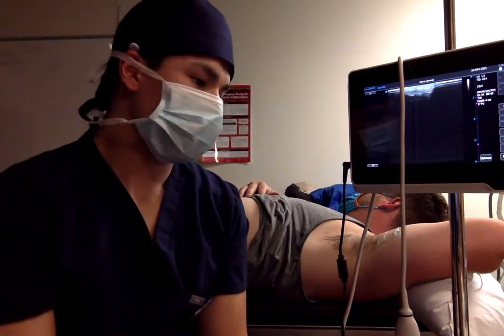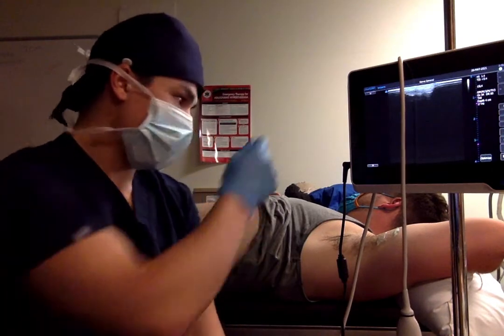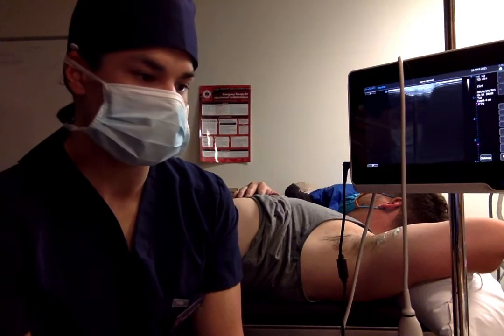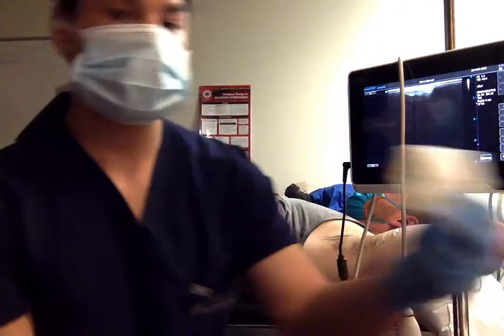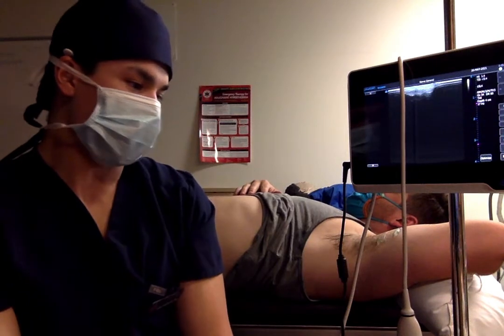I'm going to be doing a sterile procedure, so everyone in the room has to wear masks. So, mask for the patient, put that on. We're going to be using sterile drapes, sterile prep, sterile gloves, an ultrasound probe cover, ultrasound, and an assistant, and normal saline to hydrodissect with my TAP block.